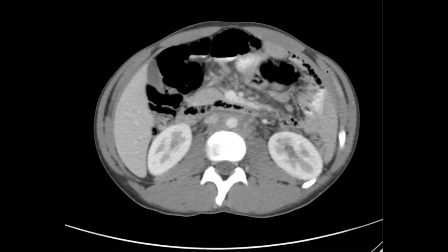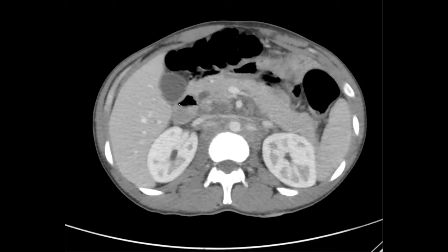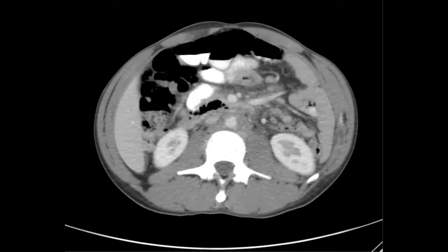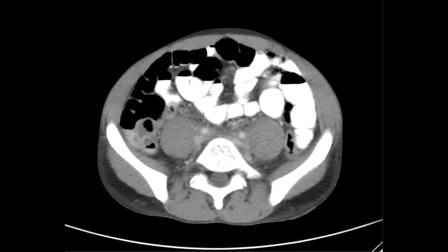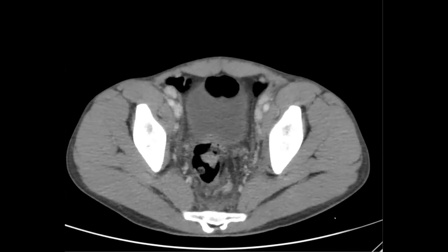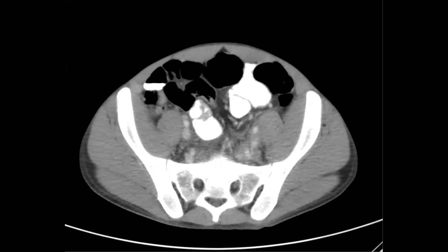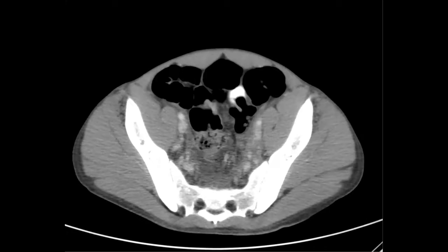And another place that Kaposi's loves is the GI tract. So look carefully to see if you see any small bowel nodules. It's usually so tiny that we don't see it on imaging, but on EGD, they frequently will diagnose it in the duodenum or small bowel. And then any lymphadenopathy also. And then look at the skin too. In this case, we did not see any nodules on the skin, but we've had other cases where we can actually see the Kaposi's on the skin. I've seen it even going down the external iliac veins and all of this perivascular soft tissue for Kaposi's. And then this last case is very cool.